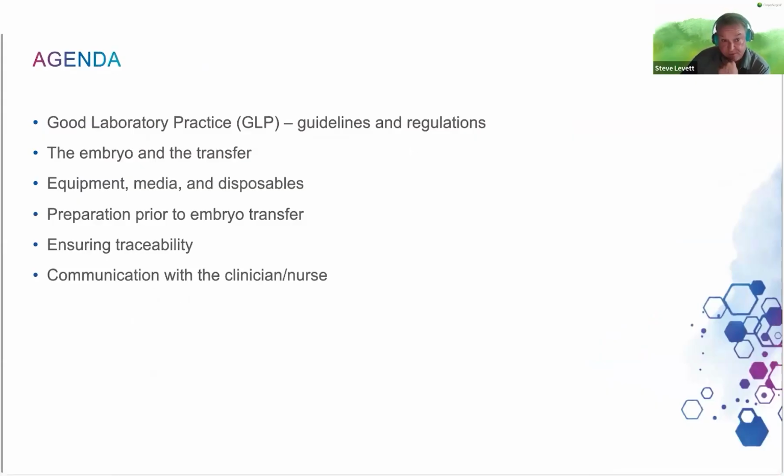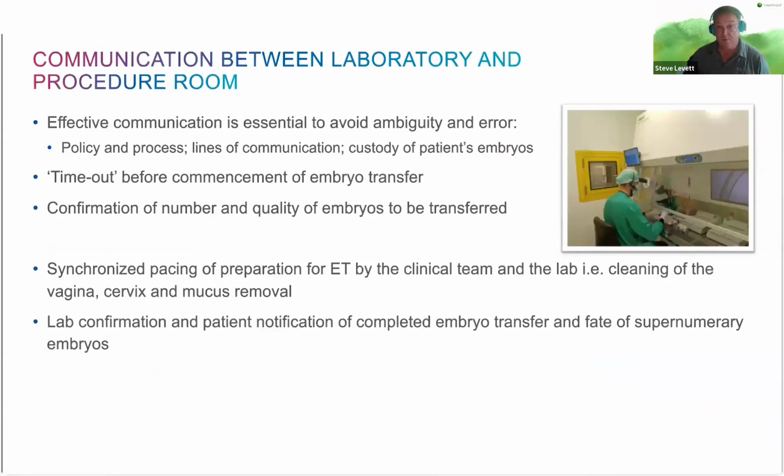Now, this is an interesting one, that communication seems obvious, but sometimes isn't ideal. When we're working, as I mentioned, in this very sensitive time where patients are absolutely invested in the outcome, it's an emotional time for them, everything needs to run smoothly. We need to identify the patient, so take this time out, reassure them, reassert the plan of what we're going to do, confirmation of the number, the quality of the embryos transferred.